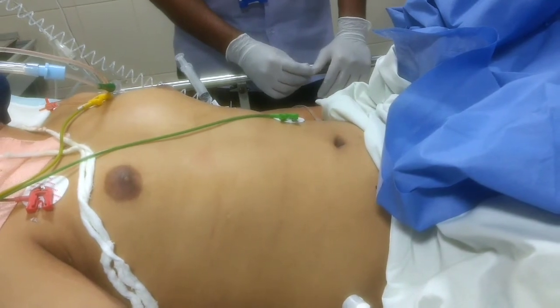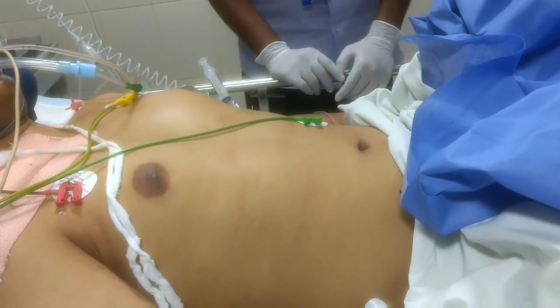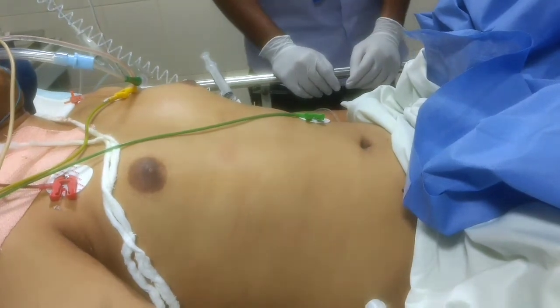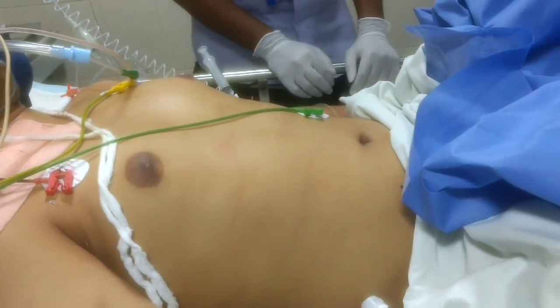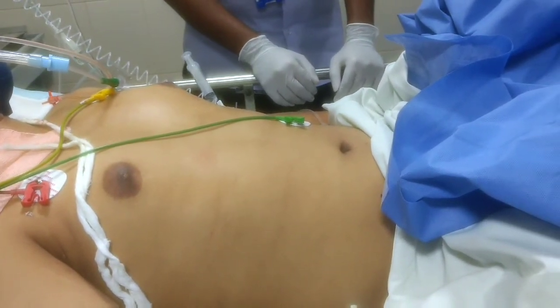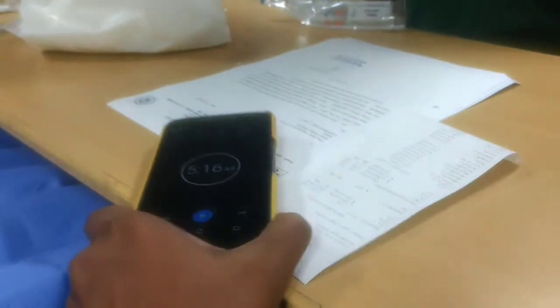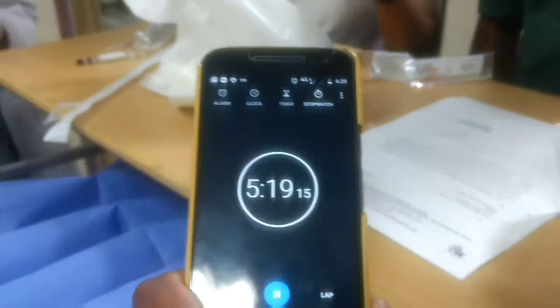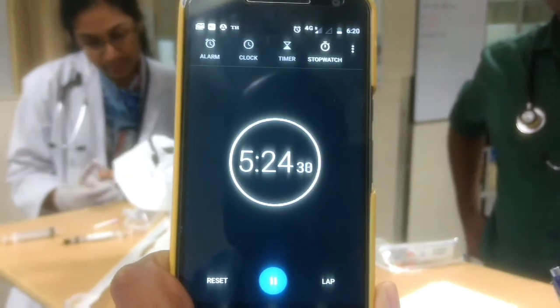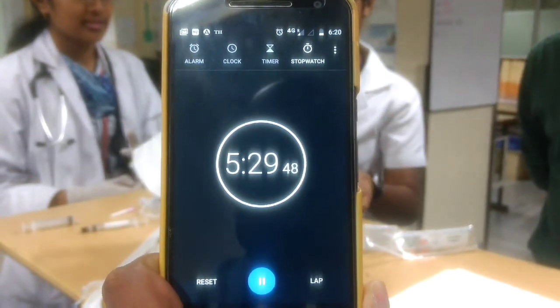Before starting the procedure, the patient should have the arterial line for easy sampling, and the central line for the inotropes and other resuscitative measures. Carefully monitor the urine output also. Okay. Monitor the time. The estimated time is 10 minutes. The overall procedure will take around 15 to 20 minutes. Keep your emergency resuscitation members and crash cart ready.